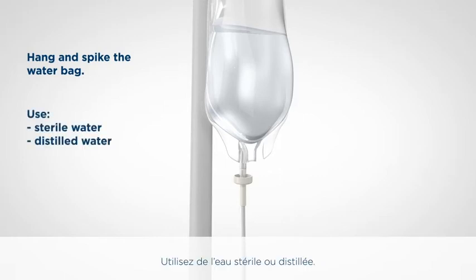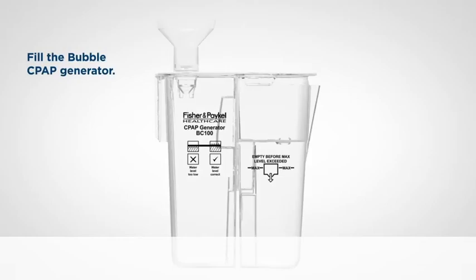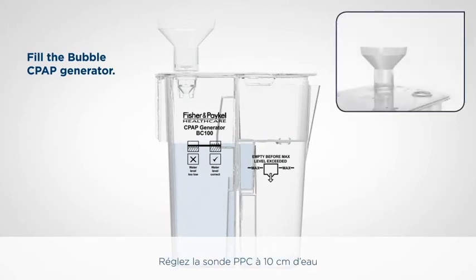Use sterile or distilled water. Do not use saline or any medicated fluid, such as glucose. Using the fill funnel provided, fill the CPAP generator with sterile water until the water reaches the maximum level and flows into the overflow container. Set the CPAP probe to 10 centimetres of water, ready for the leak test.